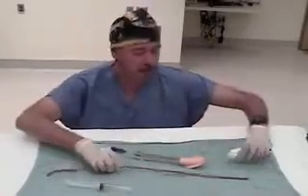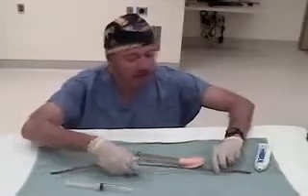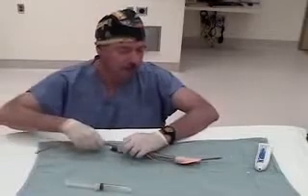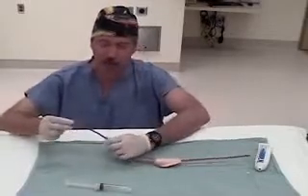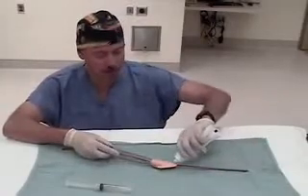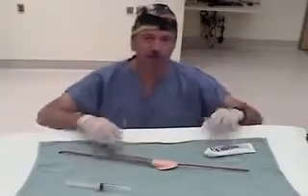The second step is to put a small amount of water-soluble lubricant on the tip of the bougie and insert the bougie through the gastric port with the hooked end coming out the top. The last step is to put a small amount of water-soluble lubricant on the dorsal side of the Proseal. You are now ready for the insertion.